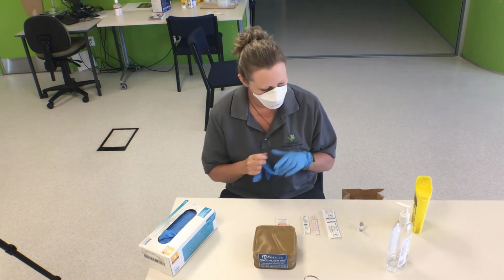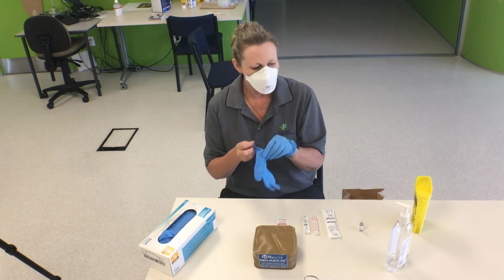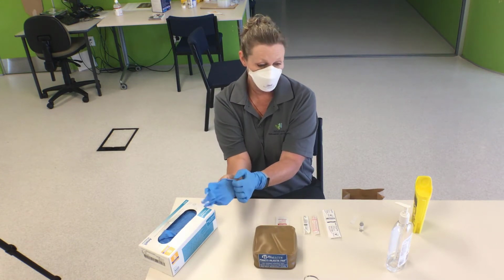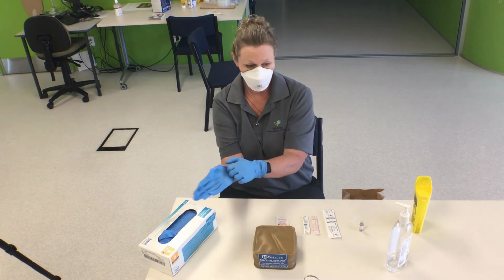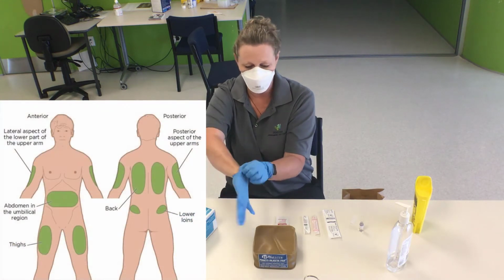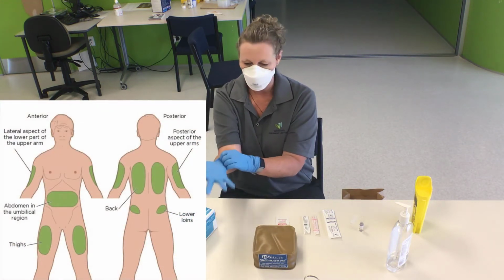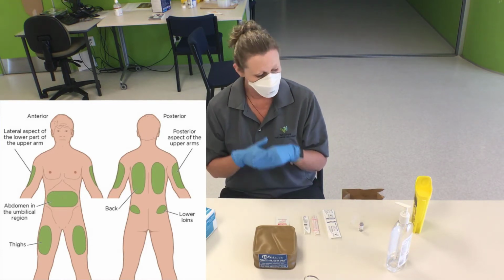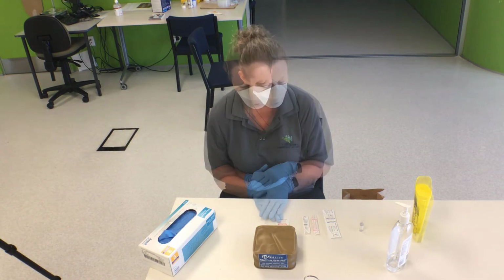So I've checked my equipment and it's all in date, and the next thing I need to do is check the site where I'm going to give it, and as you can see on the video, these are the sites that we can administer subcut. Patient may have an idea of where they actually would prefer to have that medication given.